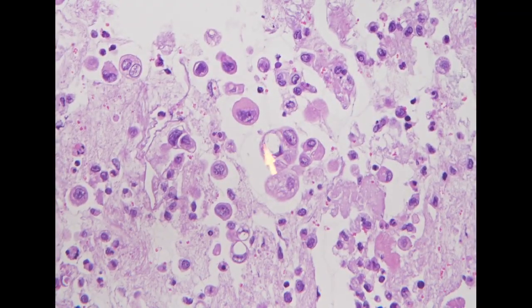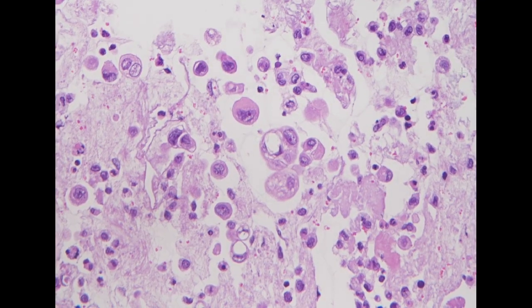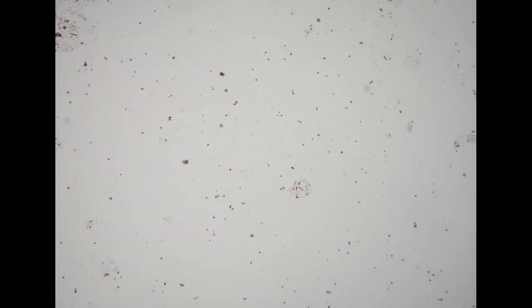So we only see two clusters of more cohesive cells that look like adenocarcinoma. But in the background, there were also a lot of single cells that we don't know if it's cancer or not. So we do a MOC31.